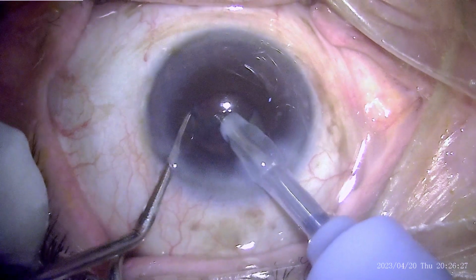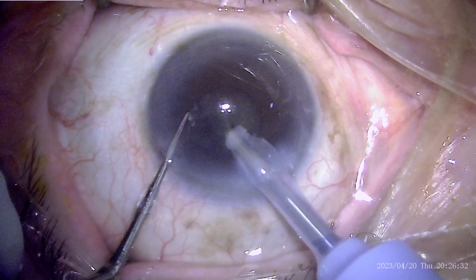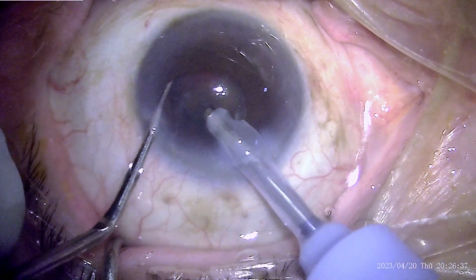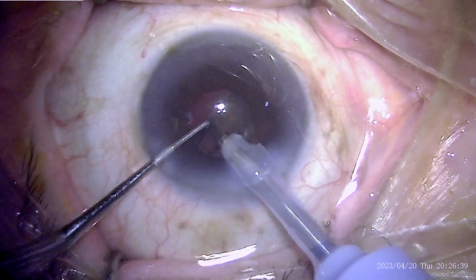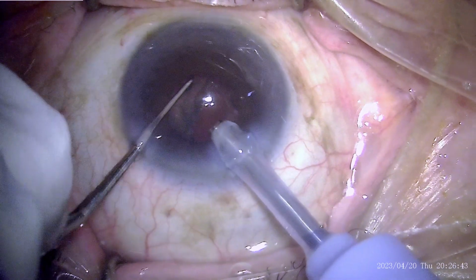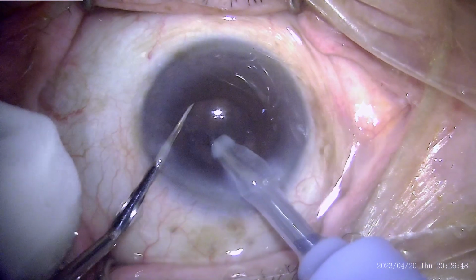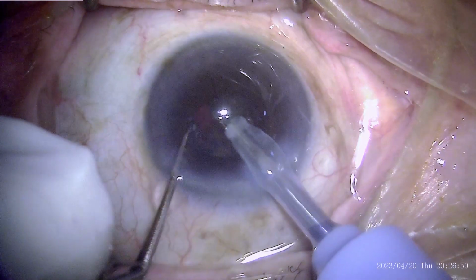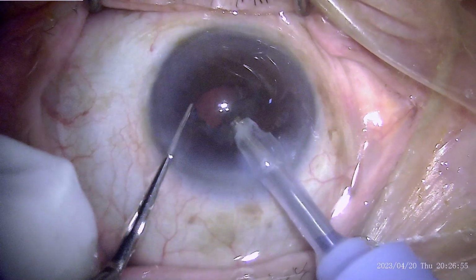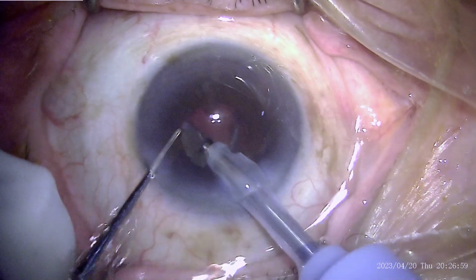emulsify them. Those pieces which are large can be re-chopped, taking care that the iris tissue is not touched, and this phacoemulsification is performed at the pupillary level. The control has to be good, and every activity has to be done in the center of the pupil. You cannot afford to go to the periphery where not only are things not visible, but also the lens tapers and the PC rises up and your safe working space is constricted further.